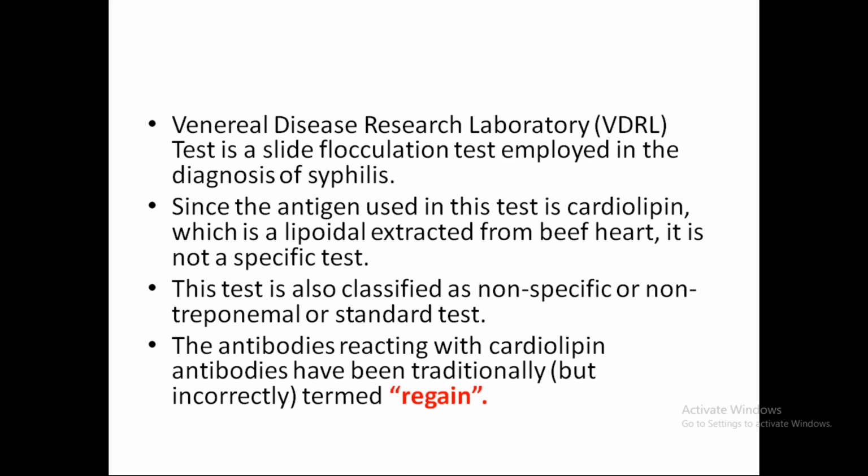VDRL, Venereal Disease Research Laboratory. The test is a slide flocculation test employed in the diagnosis of syphilis. The antigen used in this test is cardiolipin, which is a lipoidal extract from beef heart.